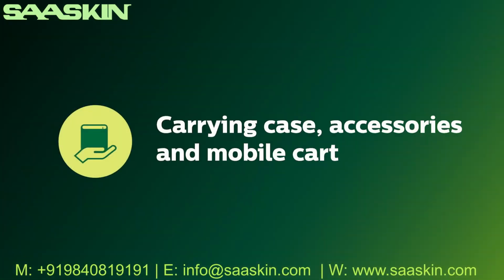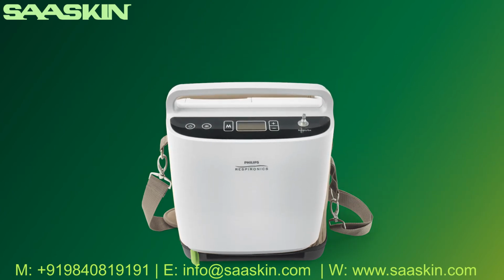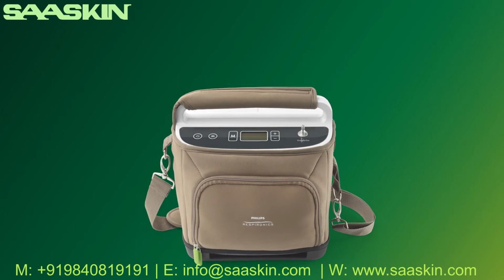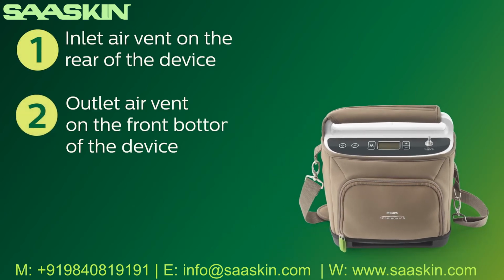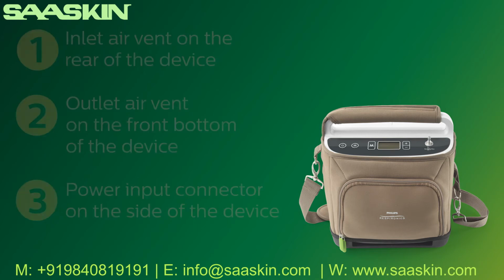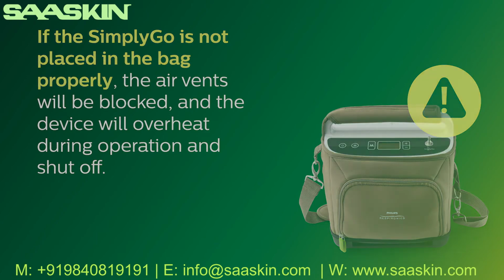SimplyGo has a carrying case bag, accessory bag, and a mobile cart for use while you're on the go. To place the SimplyGo into its carrying bag, position the bag and the SimplyGo so that the front of the device touches the surface of the bag that has a zippered accessory pouch. This will ensure that the inlet air vent on the rear of the device, the outlet air vent on the front bottom of the device, and the power input connector on the side of the device line up with the openings in the bag. If the SimplyGo is not placed in the bag properly, the air vents will be blocked and the device will overheat during operation and shut off.